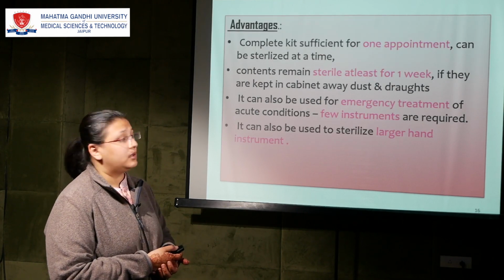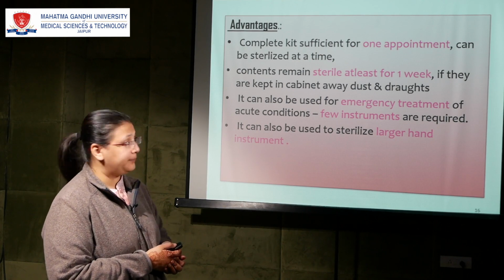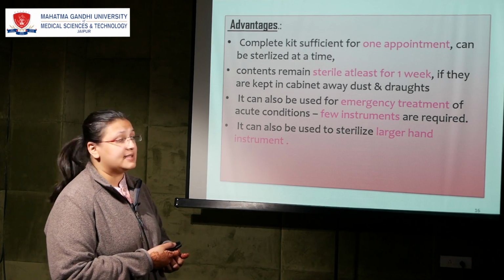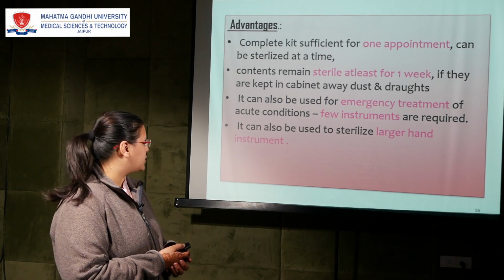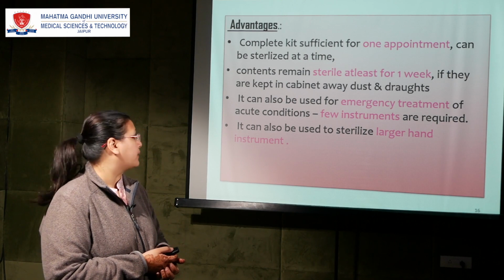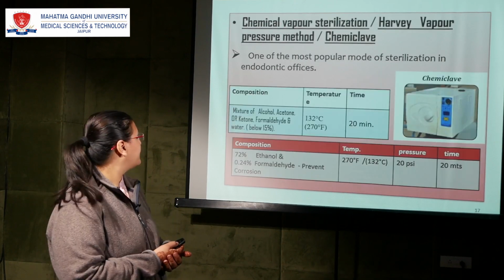The advantages were: the complete kit sufficient for one appointment can be sterilized at a time. Content remains sterilized at least for a week. It can also be used for emergency treatment of acute conditions, therefore where few instruments are required, and it can also be used to sterilize large hand instruments.